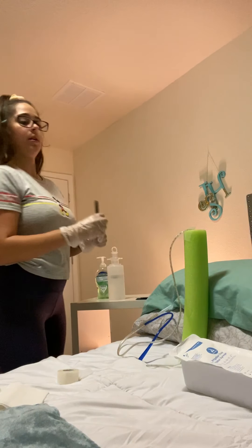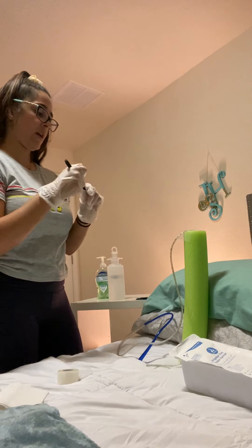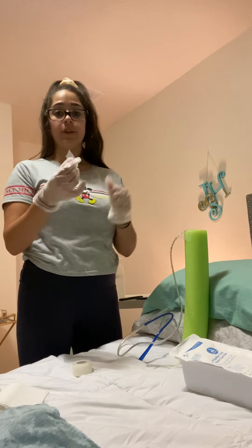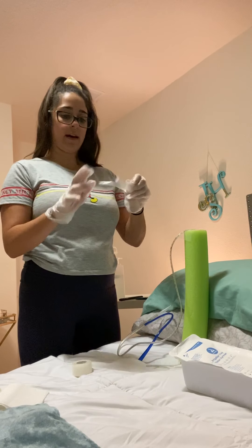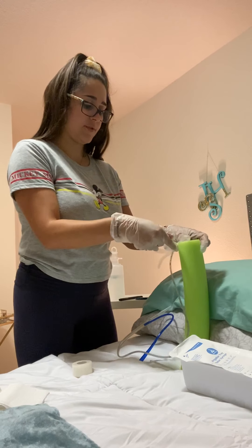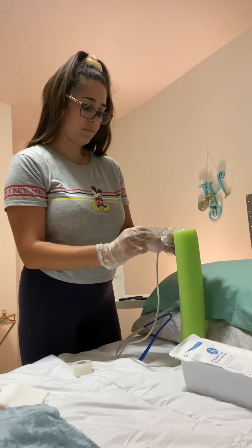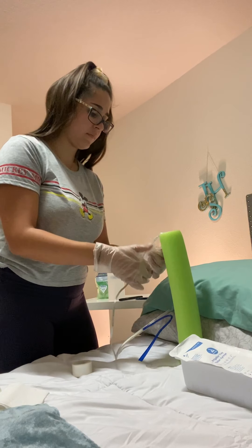Next I'm going to take a marker and mark where the tube stopped. Then I'm going to secure it to their nose using about 10 centimeters of adhesive hypoallergenic tape, ripped about five centimeters down. I'll replace the piece of tape around their nose without pulling on the tube, and wrap the two ripped pieces around the tubing to secure it in place at opposite angles.